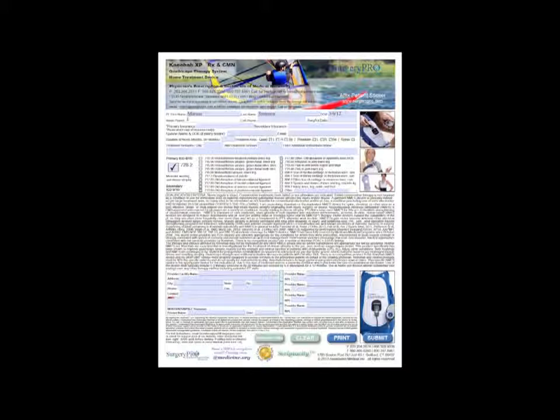I can type in phone number, cell phone, surgery or injury date, primary insurance, secondary insurance, spouse name and date of birth if my spouse were my primary insurance holder, and email if the patient has given you permission to use that. We'll, of course, confirm that they're open to receiving therein as well.